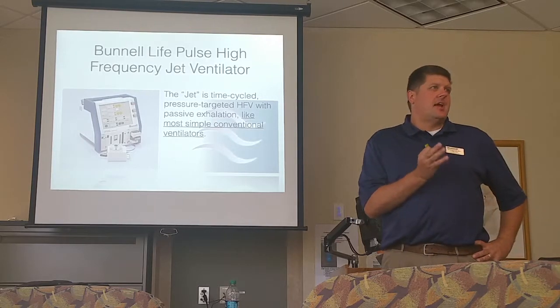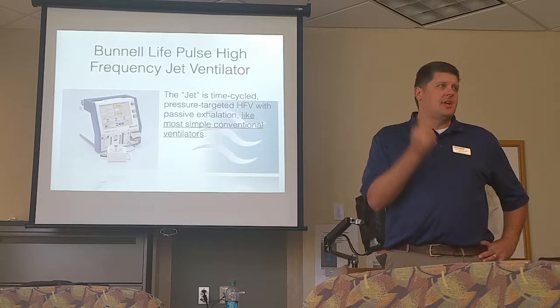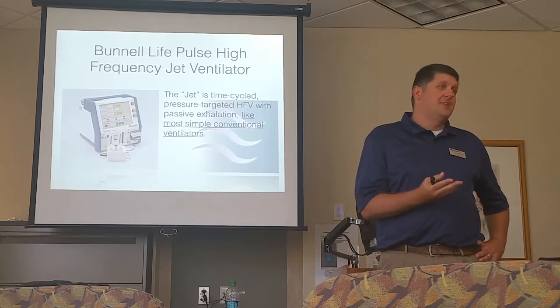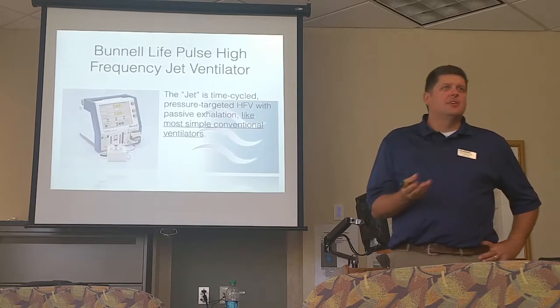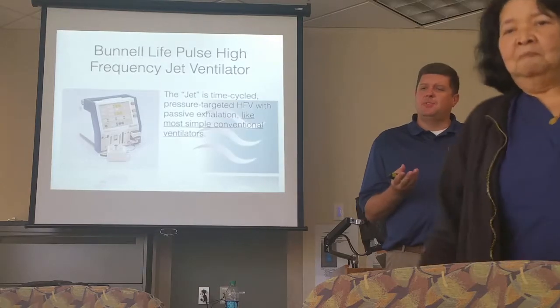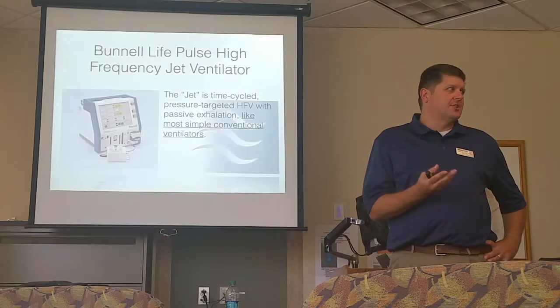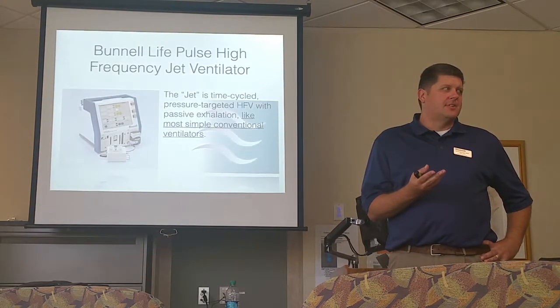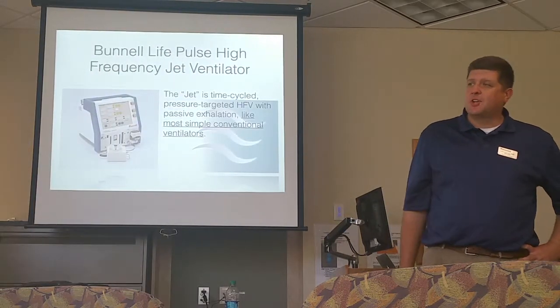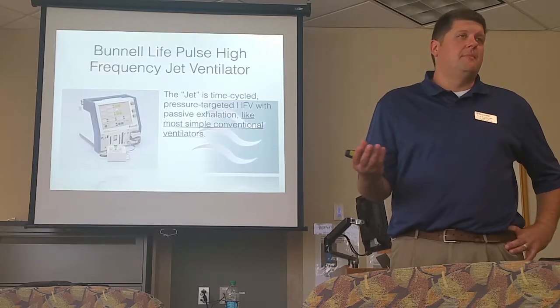Okay, but look at the machine for what it is. The jet is not scary. The jet ventilator is a simple time cycled, pressure limited machine. It's a pressure control vent. It's a pressure control modality, right? If you think of the jet, there's a PIP. You dial in the pressure, there's a set I time, and that's it. That's the vent. It really is just a good old-fashioned pressure control type vent.